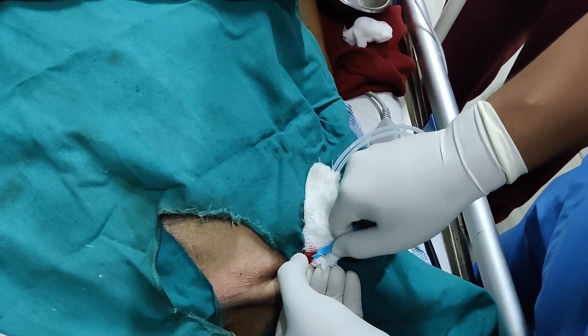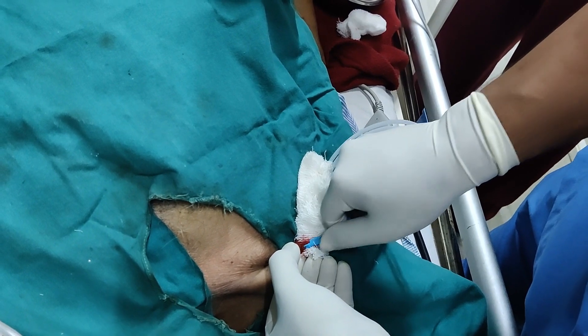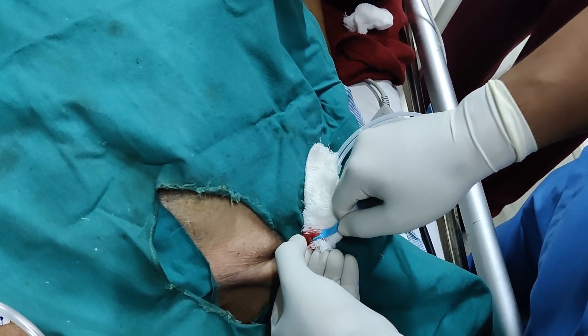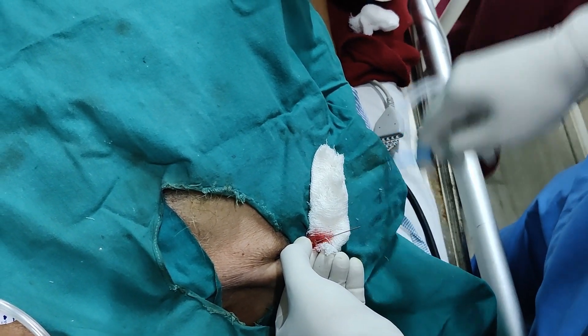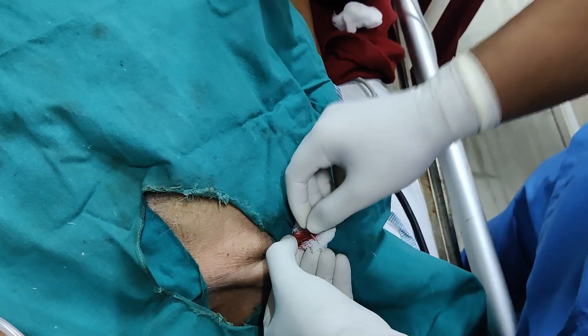Do not force the wire — it should slide smoothly. Advance the wire 20 cm, or until ectopic heartbeats occur, then withdraw from this point until ectopy stops.